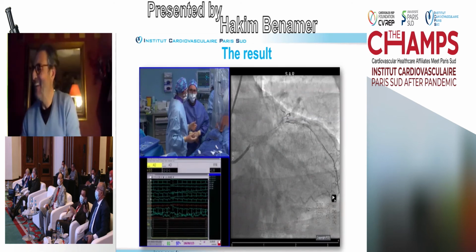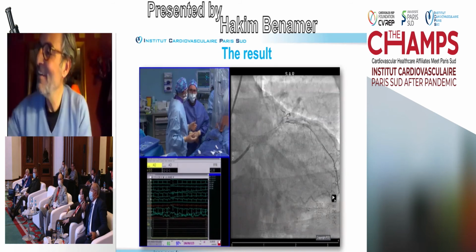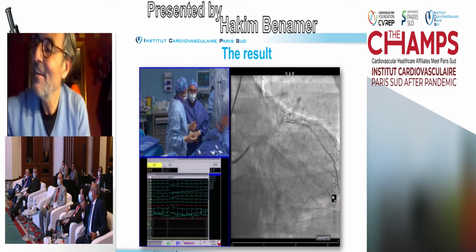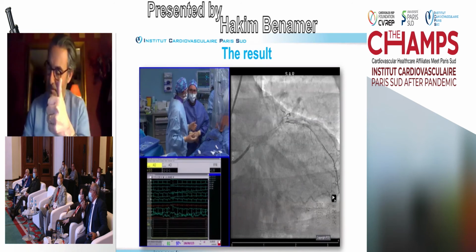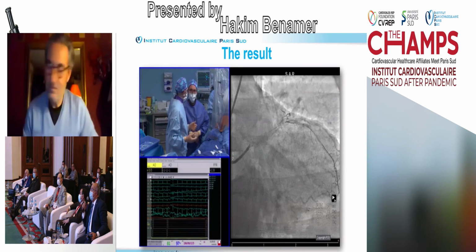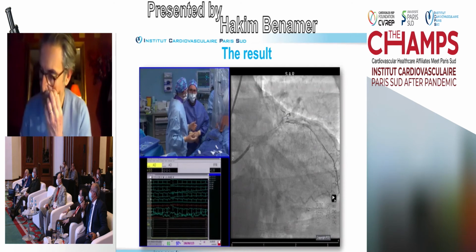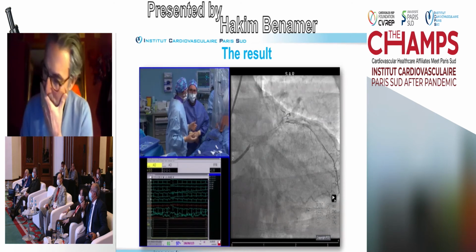Okay. I think as Professor Hakim mentioned, the first step is very crucial in redirecting and recrossing the wire again. I want to hear, if we are not able to cross with the wire used, should we... Yes, we have lost the diagonal. Yes, the patient has chest pain. And what are your tools and what are you going to do? Which wire, which views, are you going to do anything?